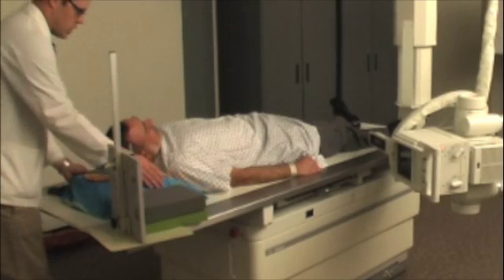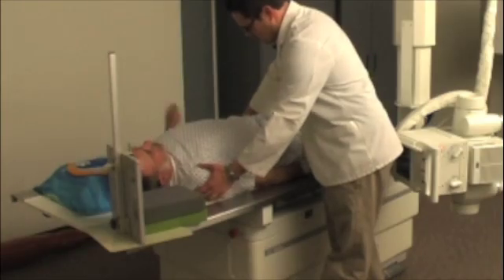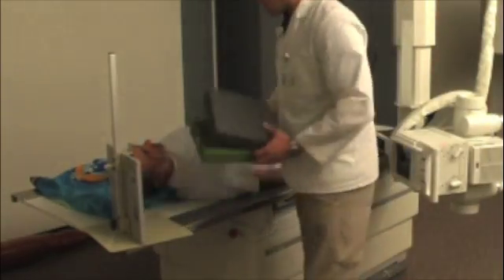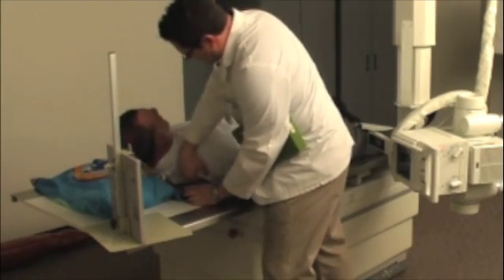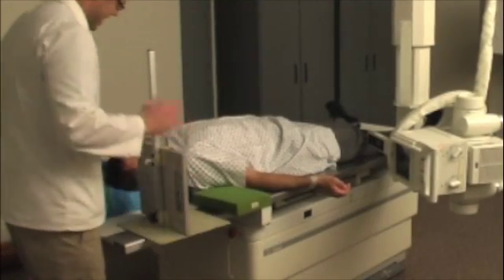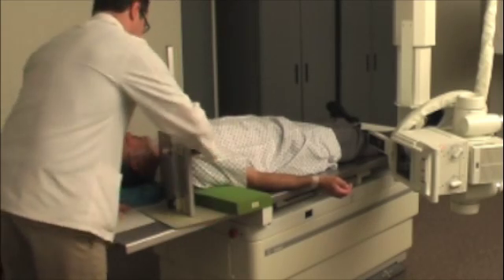Okay, sir. What I'm going to do is move this pillow over just a little bit here. I'm going to have you slide towards me on that table top a little bit. A little bit more if you could. That's good. That's pretty good actually. Now bring it close to your neck here — this will be important to get as close to your neck as possible so we can get a picture of your joint.